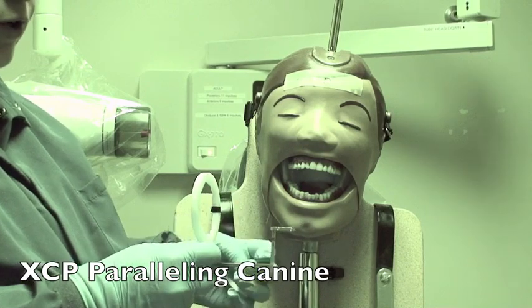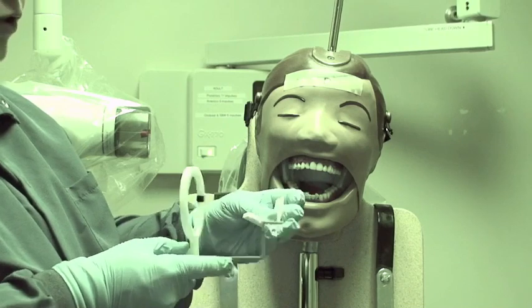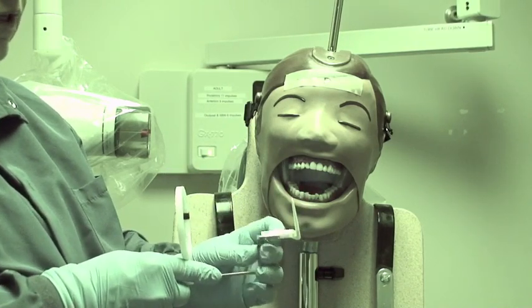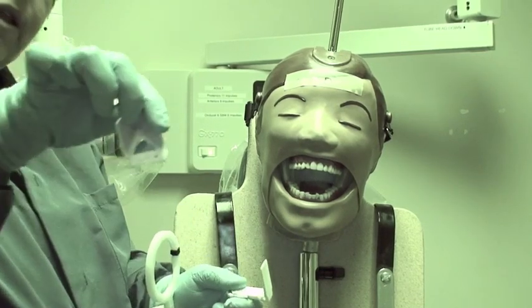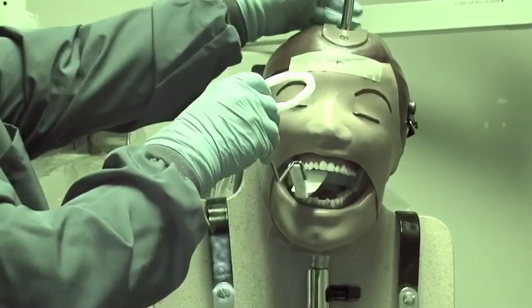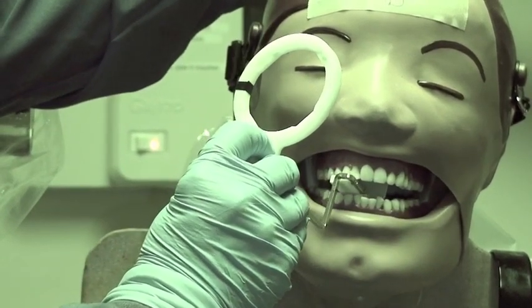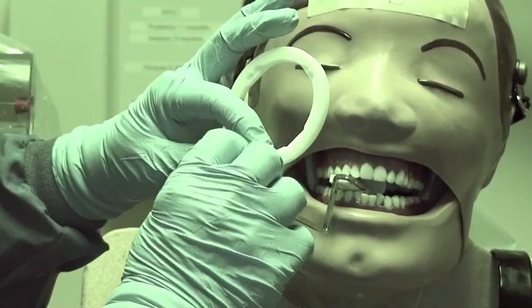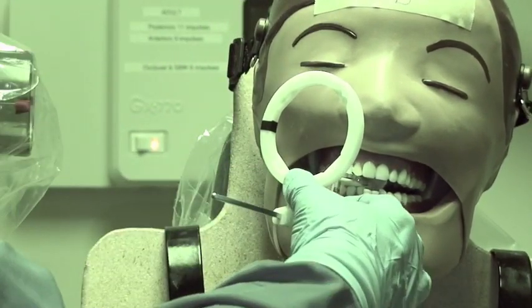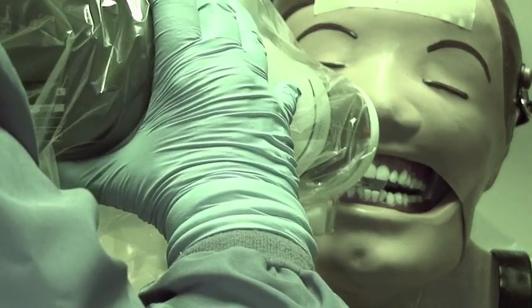Now we've switched to the anterior holder, which has more bends in it and the ring is centered over the holder. Use the vertical bite block and the two holes closest to the end of the bite block. The dot goes in the holder. Center the canine, lay it back in the palate, center the canine on your film, have them bite, then line up your PID parallel to the ring.